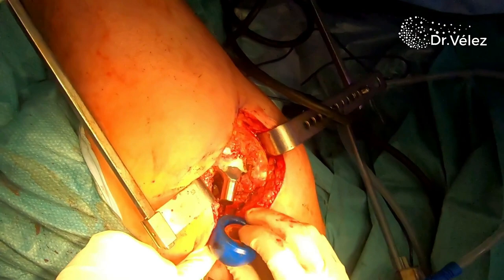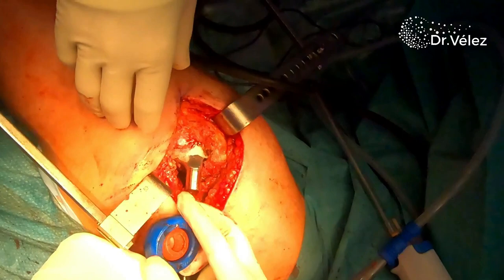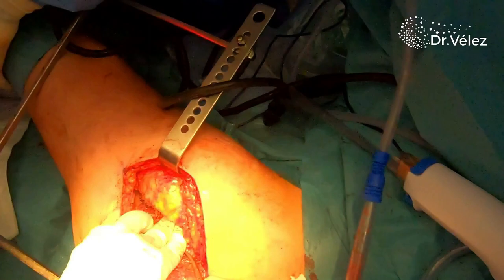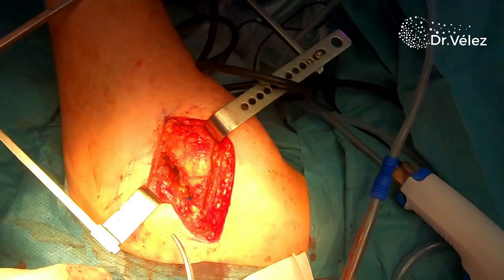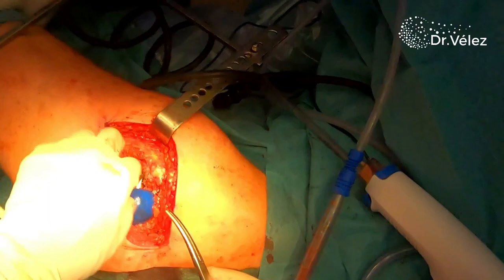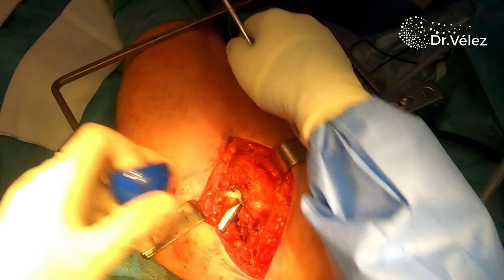After the cement has hardened, we can check with a scalpel if it's okay. We then take the trial 47 millimeter head and reduce it carefully. With this trial head, we check for stability in flexion, internal rotation. We also check for tension in extension. And if we're happy with it, we then proceed to implant the definitive 47 millimeter bipolar head.